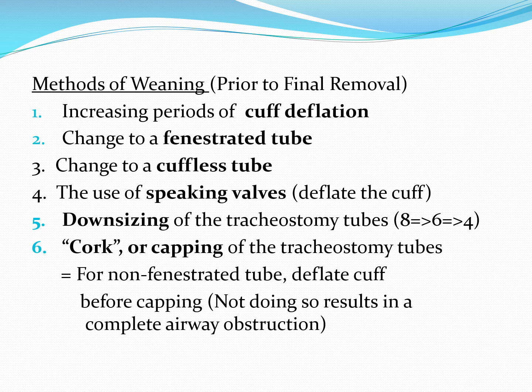And often this is accompanied by, if you will, corking, which is a slang expression, but capping the tracheostomy tube for a period of time, so that again, it's an uncuffed tube. It may well be fenestrated. By capping it, you're actually allowing the patient to breathe through their upper airway, though the tube is still in place. Should their progression cease and they start regressing and get clinically worse, they may need to have that airway maintained for ventilation, secretion removal, and those sorts of things.